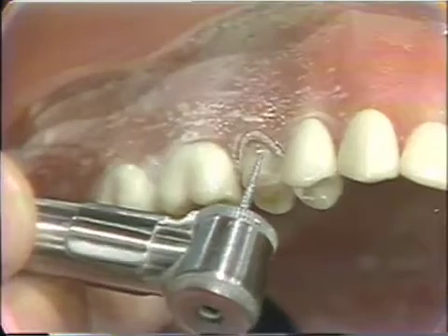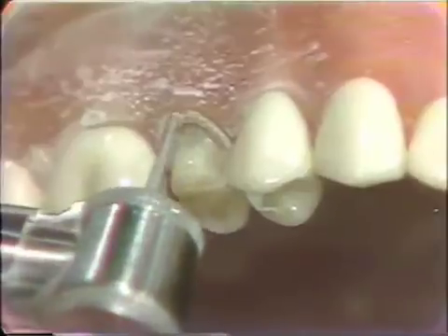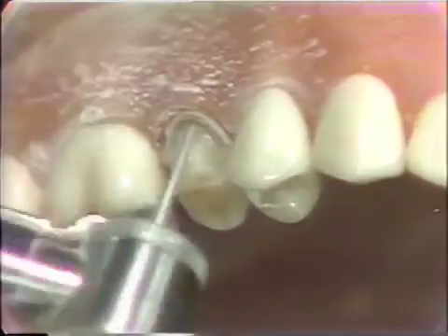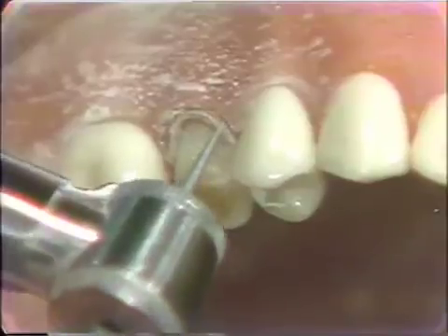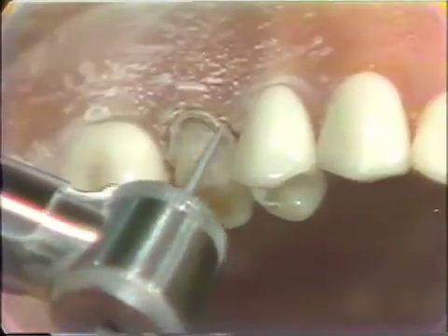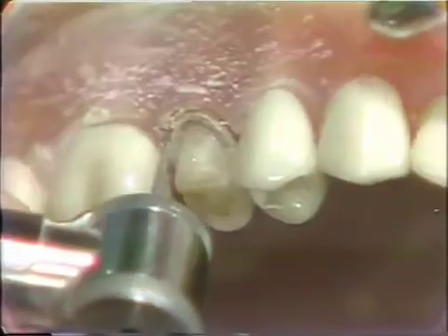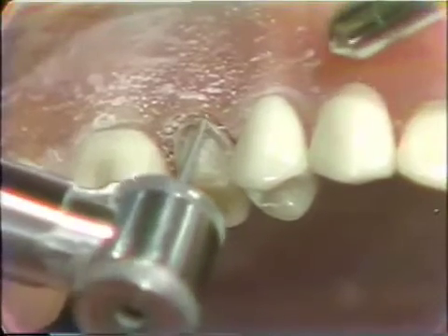We will place this bevel by using a very light touch. It does not have to be a very deep bevel — it is a very slight bevel. This bevel will go from the buccal right into your interproximal slice that you made just previous to this. This should be a very sharp and distinct finishing line that will be readily visible on your die.